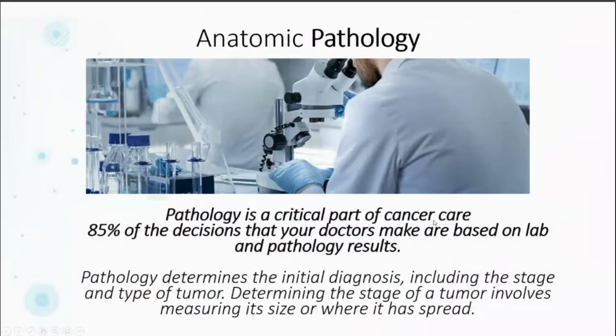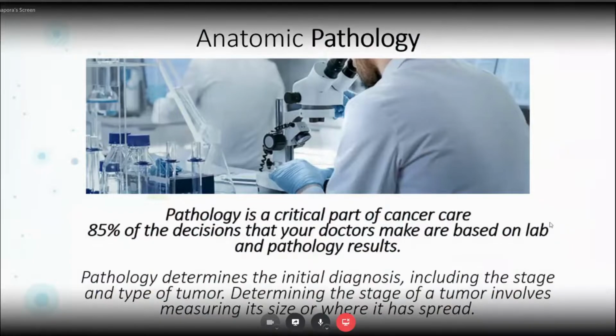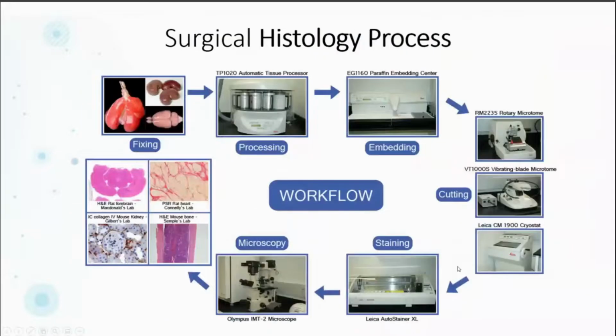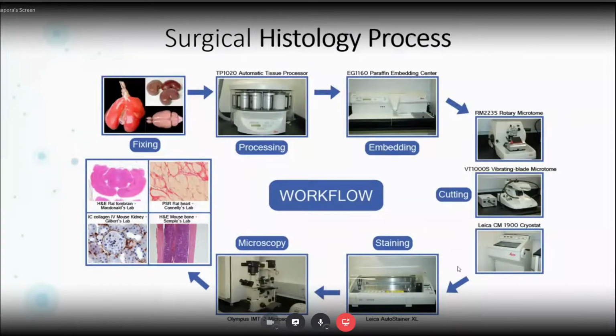But I'll give a quick overview of the digital pathology domain, and then we'll go into the code of this particular custom parser. So for those of you that aren't familiar, anatomic pathology is used in cancer diagnostics, and it's kind of the last stage as a cancer is being graded and a therapy is being prescribed for the patient. Anatomic pathology is a critical part of making that diagnostic work.